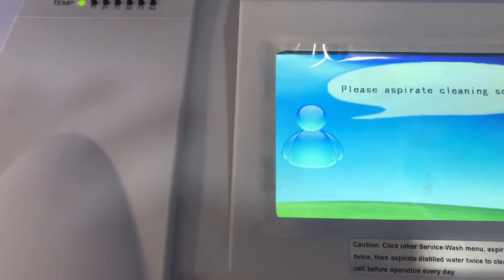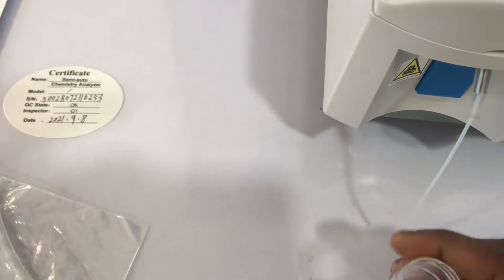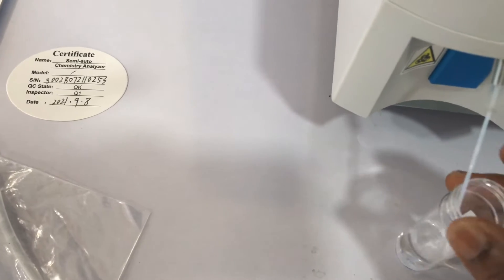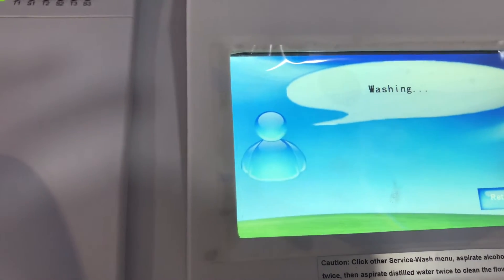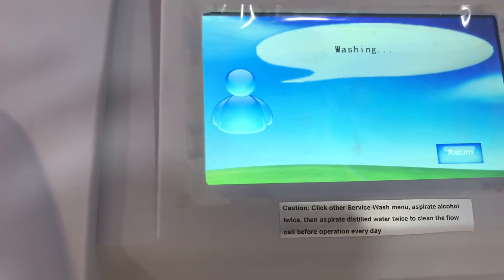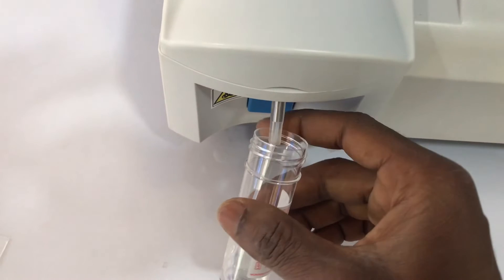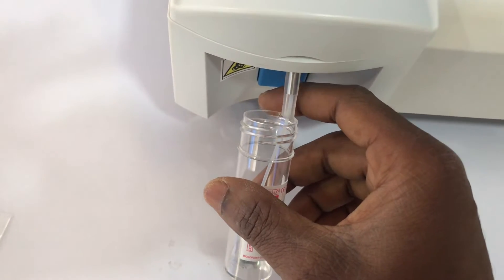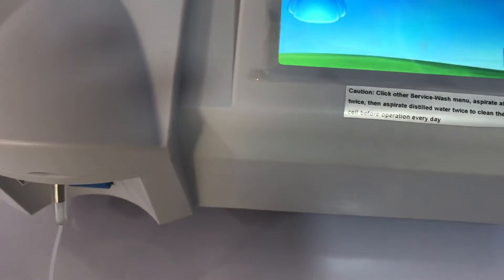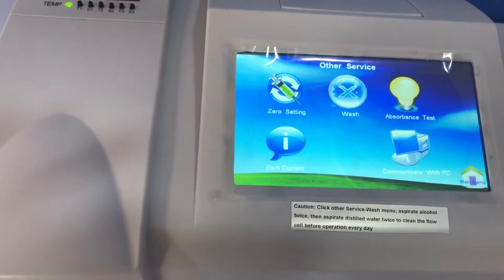After the alcohol wash is complete, you click Return, then click Wash again and aspirate the deionized (DI) water. You place it in there and click the aspirate button — it will aspirate and wash with the DI water. You do this for both alcohol and deionized or distilled water. This is the first maintenance procedure you are supposed to do every time you start the machine — it's very important.